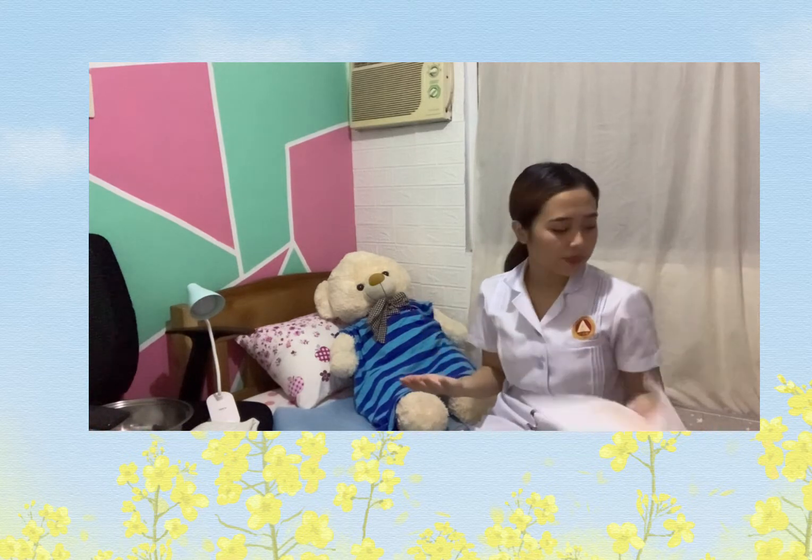After that, for the implementation, first we need to check the doctor's order. For this patient, the doctor's order states that the patient needs Perilite exposure, most especially on the perineal area of the patient, that will last for 15 minutes. And then, we need to introduce ourselves to our patient, verify our patient's identity, and explain to our patient how they can cooperate throughout the procedure.